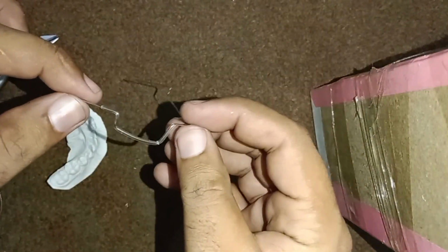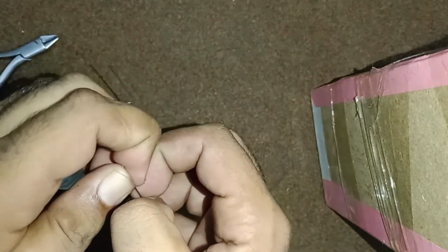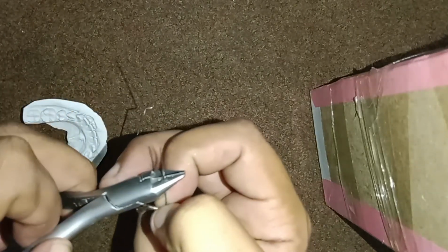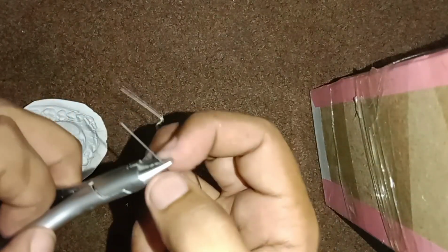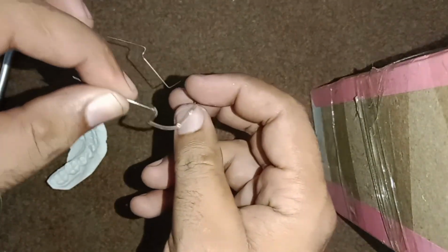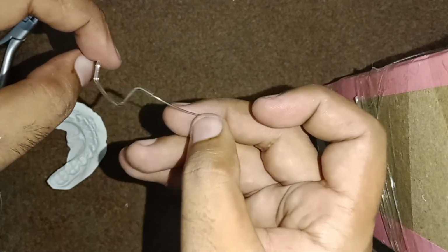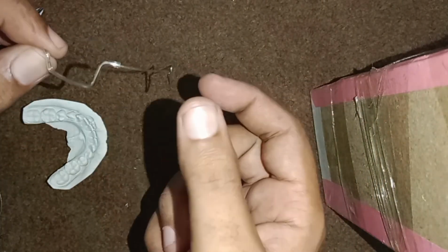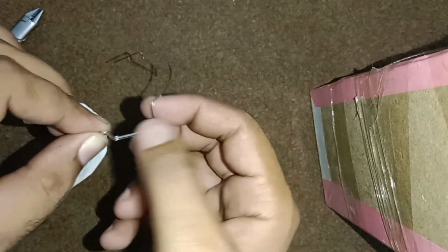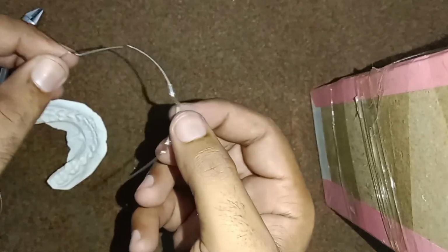You can see that we have slowly passed the archwire sleeve on the wire. This archwire sleeve will make the wire comfortable for the patient. Similarly, we will pass a section of archwire sleeve on this side as well, so that with the archwire sleeve, these segments are very comfortable for the patient.